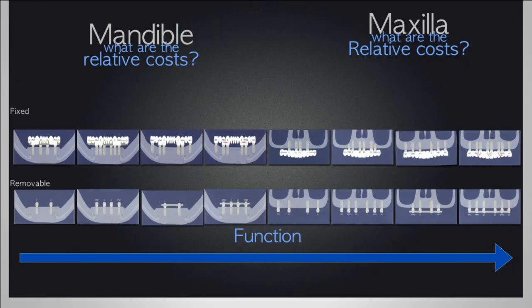What we tend to find is that once you get beyond a certain level of rigidity, and this tends to come with retention bars, and especially retention bars that have a rectangular profile rather than a pear-shaped profile, you'll tend to get more retention for those particular implants.